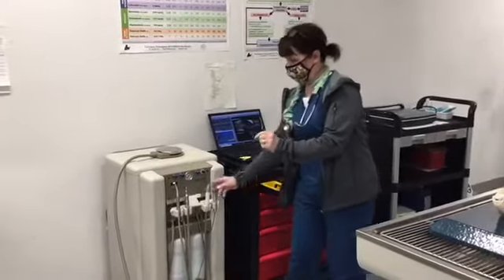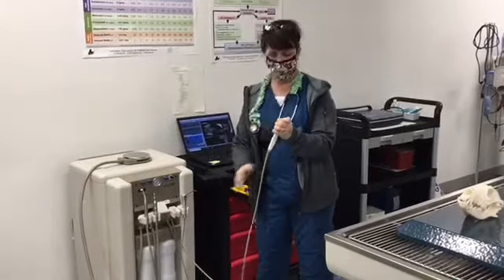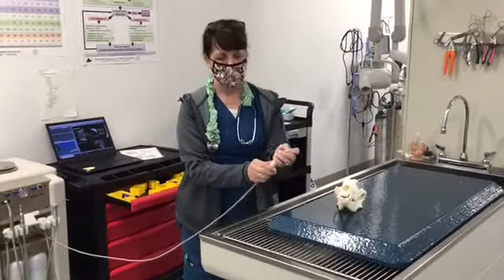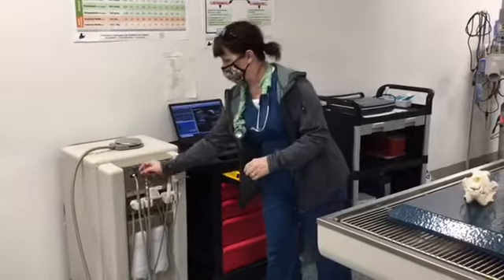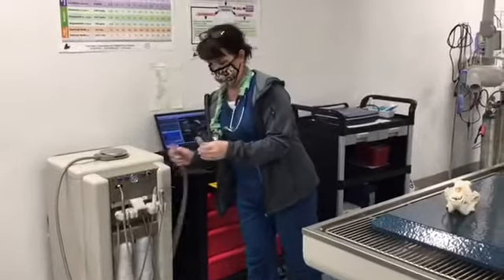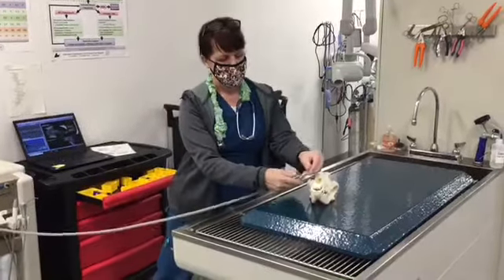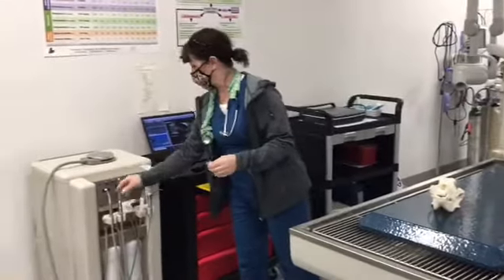So these are put on the machine, and I have a pedal that I use, and we would scale all the tartar off and get those teeth clean with the scaler. And then I have another piece that we use for polishing the teeth. There's a little rubber piece that goes on here, and we polish up the teeth. They're nice and shiny after that.